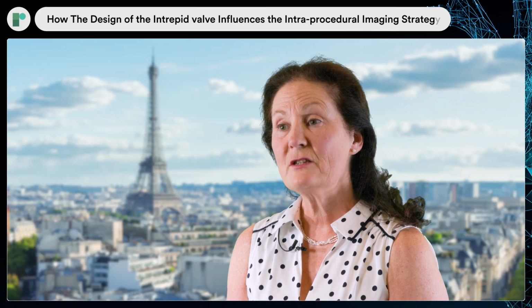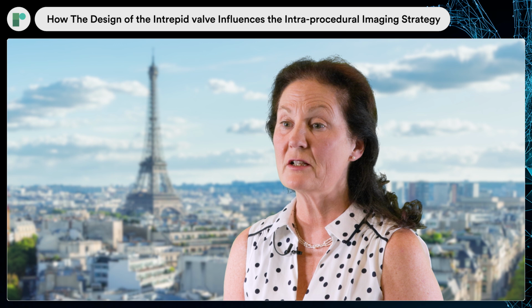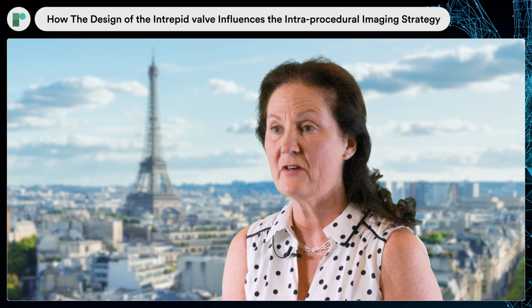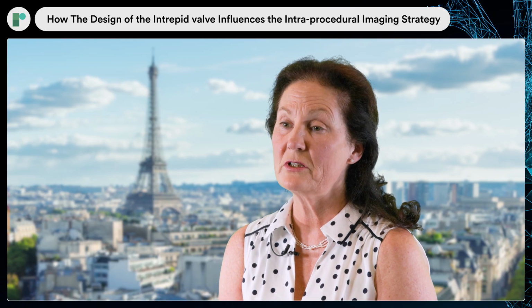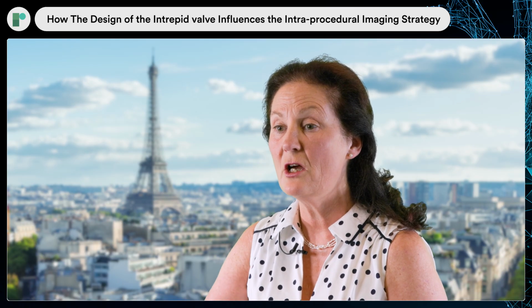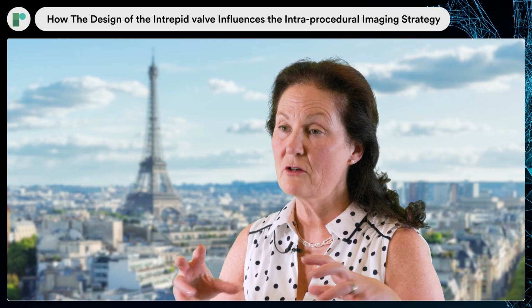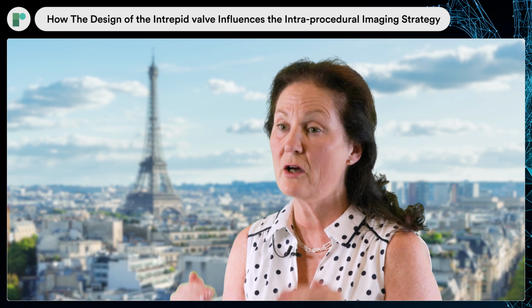This is a transfemoral transeptal procedure, so we need to have good imaging of the interatrial septum to start with, and a good enough interatrial transeptal puncture site to be able to manipulate the guide catheter into the mitral valve annulus itself. As I mentioned already, because it's a circular valve, we don't have to worry so much about clocking or orientating the valve within the mitral valve annulus, but we need to make sure that we've got it at the right level of the mitral valve annulus so that the retaining elements are pushing out into the annulus and not too high, not too low.